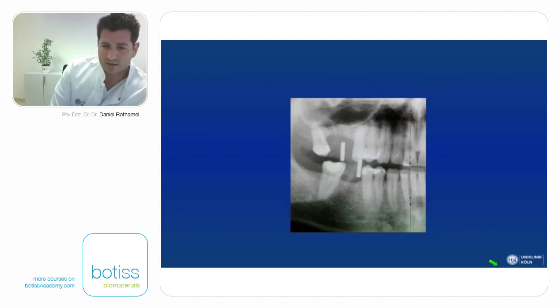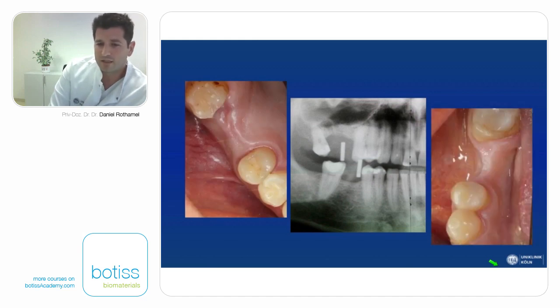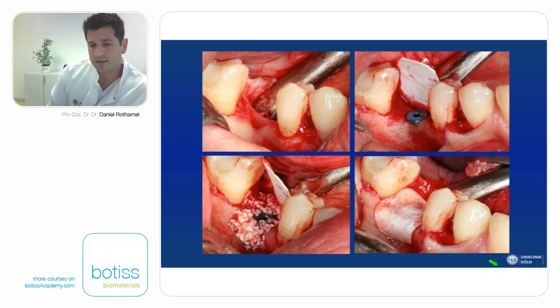So another case, a vertical defect in the maxilla and also a horizontal defect in the mandible, as already mentioned. So when we use bone substitute materials, it's recommended to use membranes. You can either use resorbable or non-resorbable membrane. What you see here is a pericardial membrane that is quite stable with a long-lasting barrier function. We use this membrane for all our augmentation when we use bone substitute materials, because this long-lasting barrier function is leading to a very predictable outcome. So some cerabone particles underneath, and then after rehydration the membrane is getting a little bit more flexible, stabilizing the graft area.